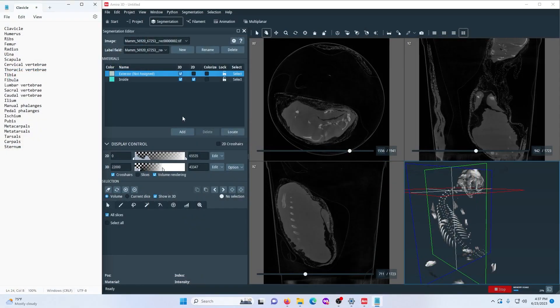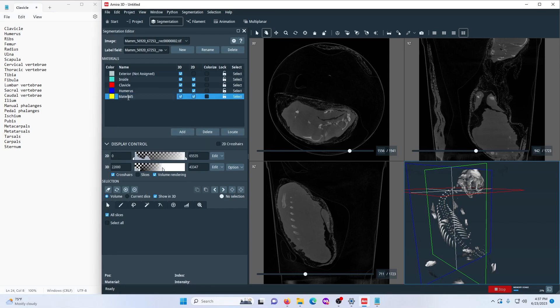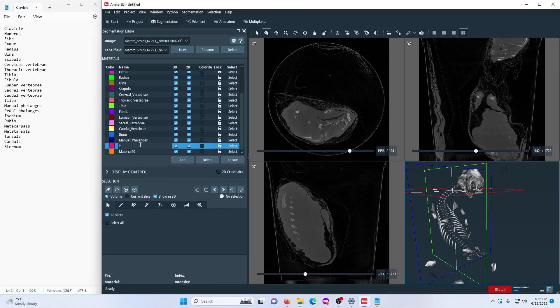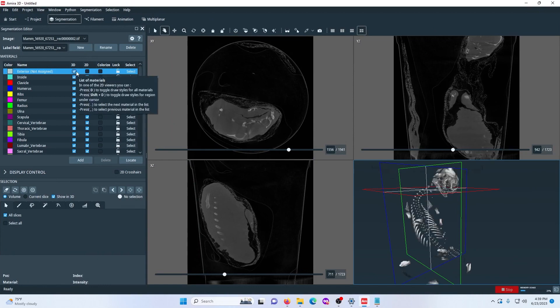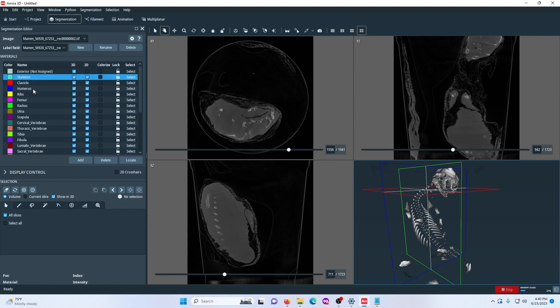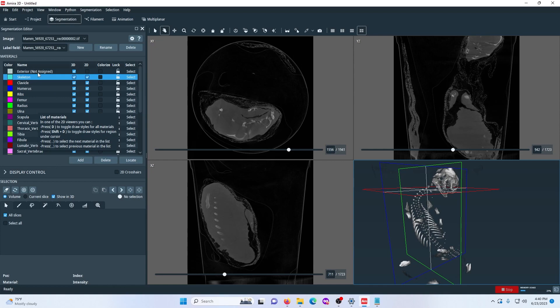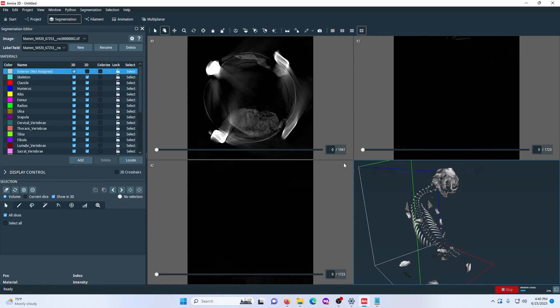So the first thing I would do is add in all the segments that you want at once. So you're going to go into materials and add in everything that you want to separate out. So you can see on the left here that I have a list of everything that I want basically. And that's what I'm going to be segmenting, which is just like separating and labeling. Let me quickly explain what this is. So exterior is basically everything. It's everything that hasn't been assigned yet. Inside is just the default one. It's empty at first and you could add stuff into it. I usually like to rename this one skeleton for what I do because I just put everything that's like a bone into there. So add allows you to add layers. Delete will take everything out of that material and put it back into exterior and then locate will just show you where that material is.